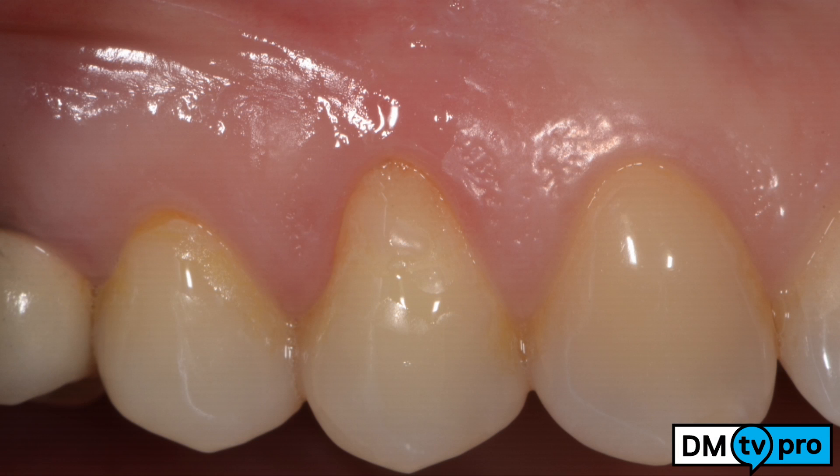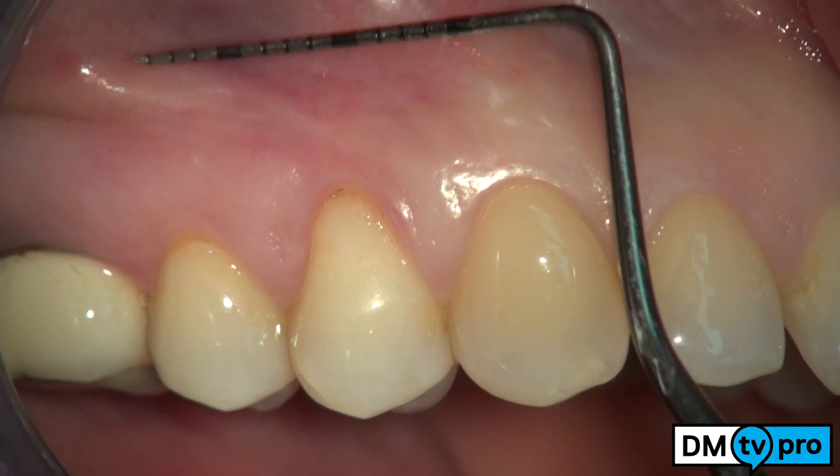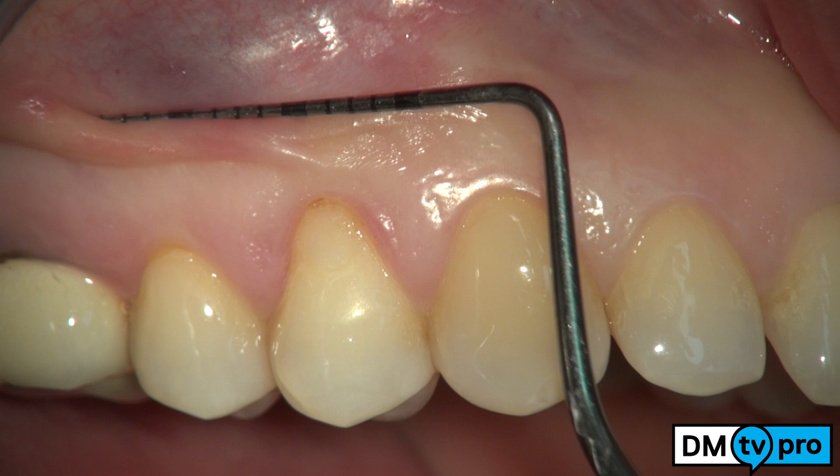An upper right first premolar shows a shallow gingival recession. There is still a small amount of keratinized tissue, less than 2 mm. A coronally advanced flap without vertical releasing incisions is planned in combination with a mucograft collagen membrane as a substitute for an autogenous connective tissue graft.